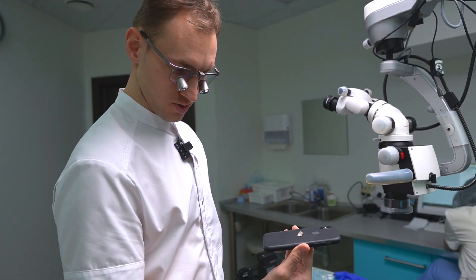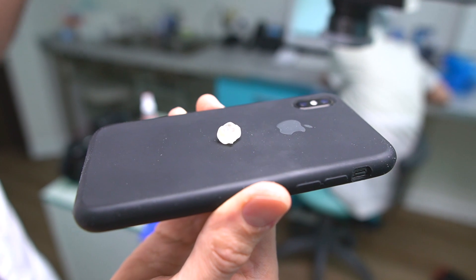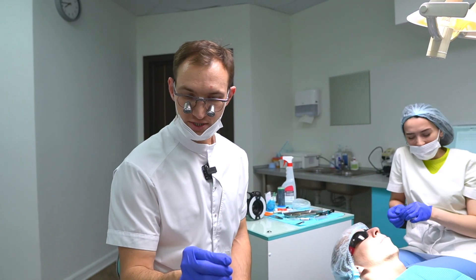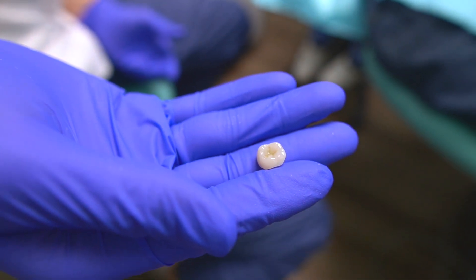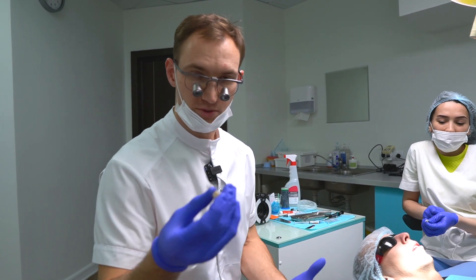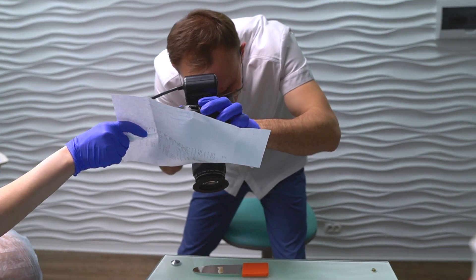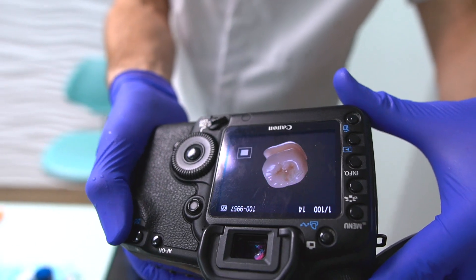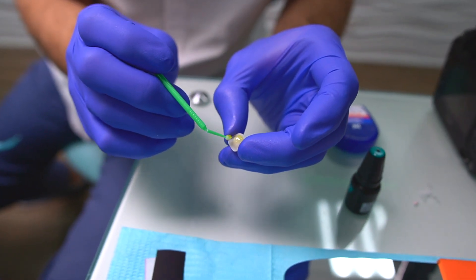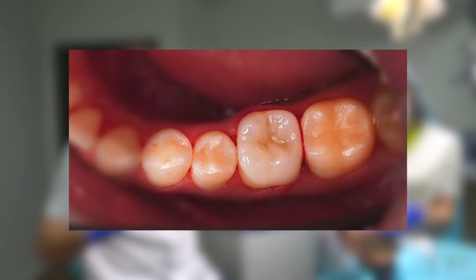We have our overlay from the MCXL. Now we have to apply staining and glazing and put it in the furnace. The CAD CAM overlay is ready for our patient — it fits well. Now we have to install it in the mouth with composite resin. The overlay is already installed in the mouth, and now we have to finish this work with polishing.